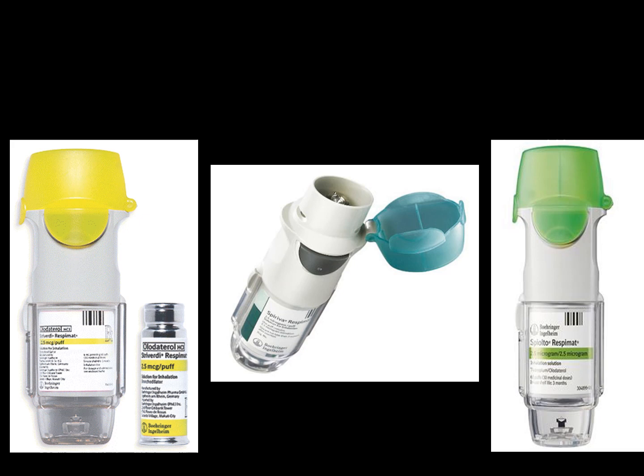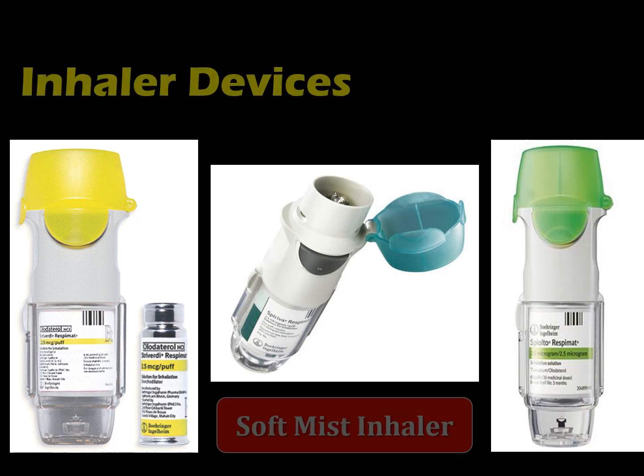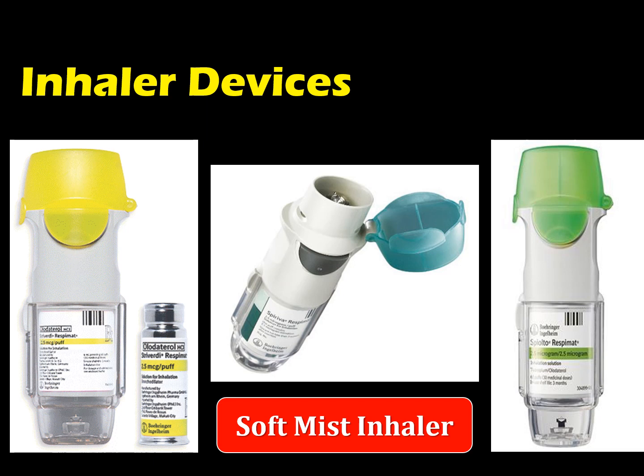And then we have the soft mist inhaler. This inhaler is still patented under one company, Boehringer Ingelheim. The very good advantage of the soft mist inhaler is that it doesn't require a high inspiratory flow rate compared to the dry powder inhaler. So there's no need for the patient to inhale deeply, just regular inhalation or regular breathing.